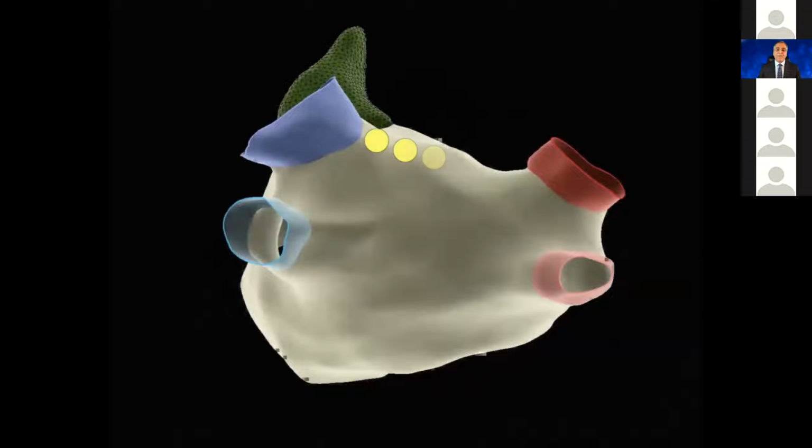Remember, you do have your mapping system as well. So that would help you as well. So you know that you're really burning there if, at the very beginning, you have any doubt.